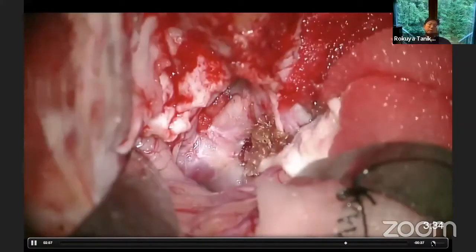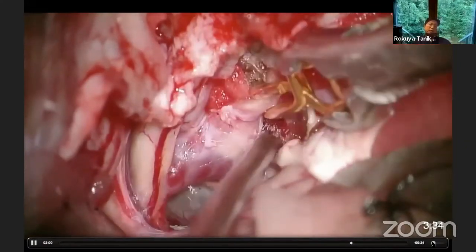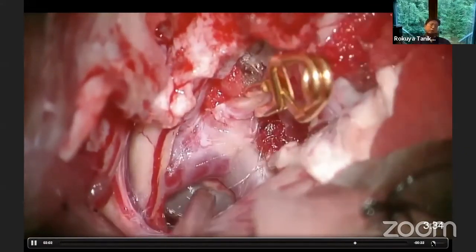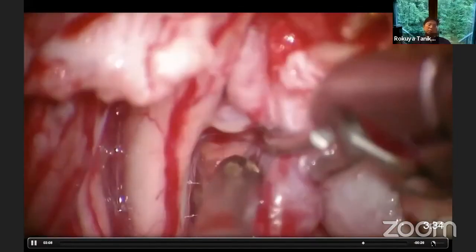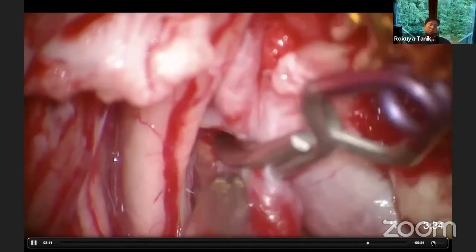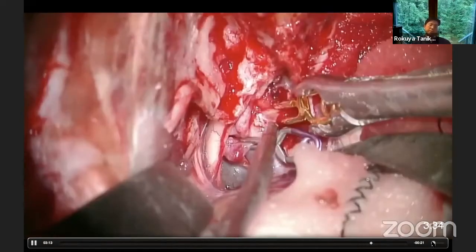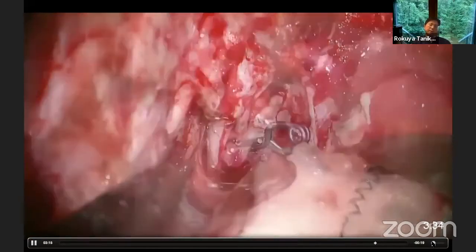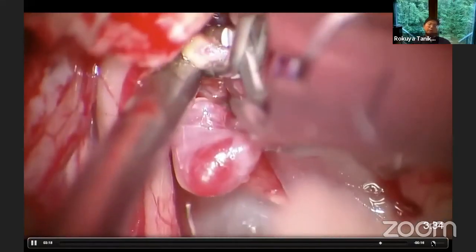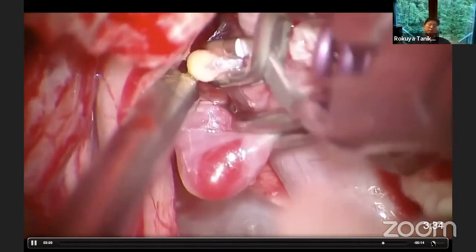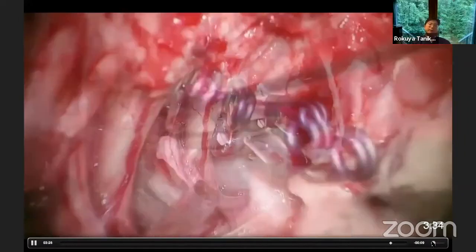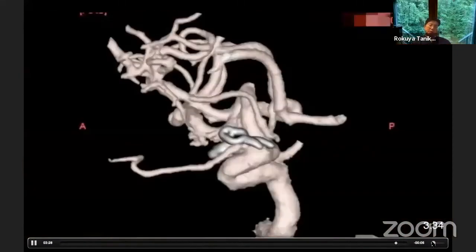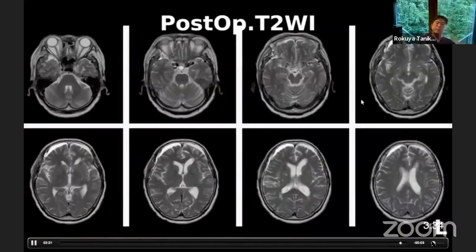The relationship of the anatomy is very important. Then I am trying to do test temporary clipping of the ICA to reduce the tension of the aneurysm. You can then perform neck clipping safely. Additionally, the tiny ophthalmic aneurysm is also clipped. This is the anterior clinoidectomy and paraclinoid aneurysm clipping. Postoperatively, nothing happened — the outcome was uneventful.